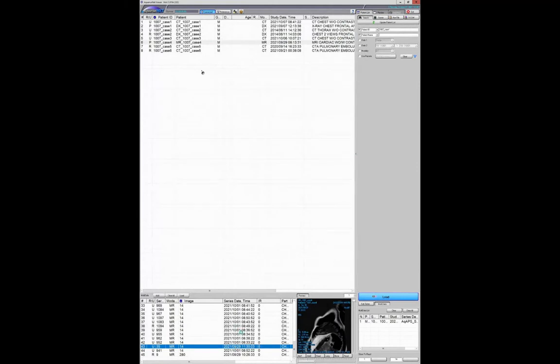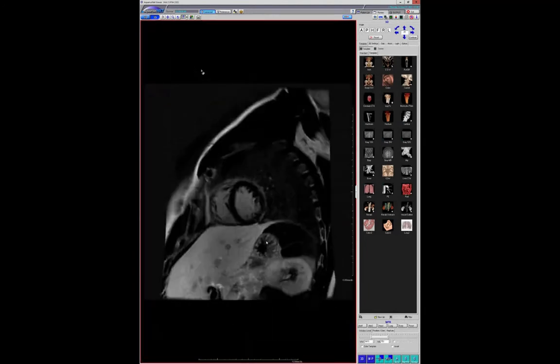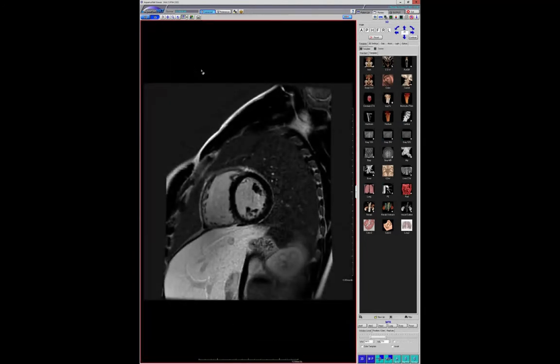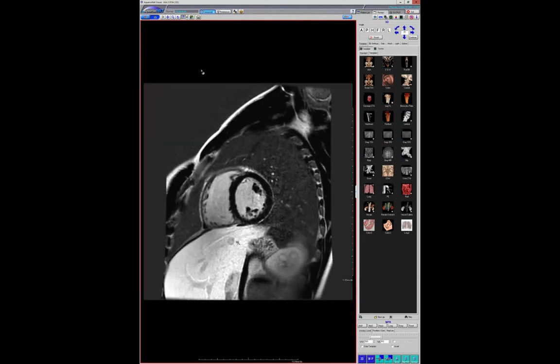Here we go. And this is, oh my Lord, what happened here? Here we go. So if you look, you can see this RV insertion point. And I hate calling this. Normally I say, sometimes the RV, especially in people with dilated cardiomyopathy, kind of dips underneath. Even in a normal patient, you get the RV extending inferior to the point of the LV. And you're just seeing gadolinium blood pool here. But this wasn't the case.